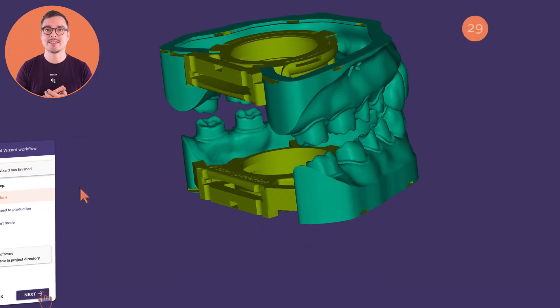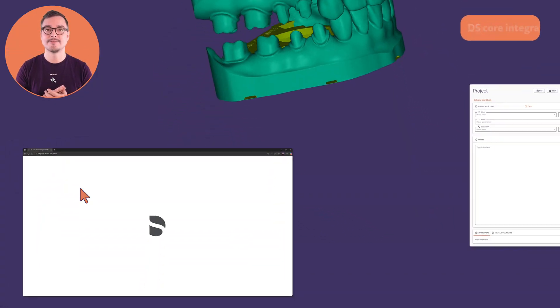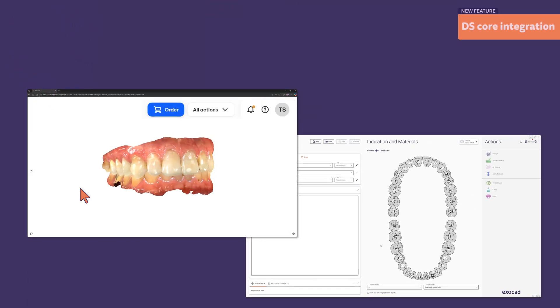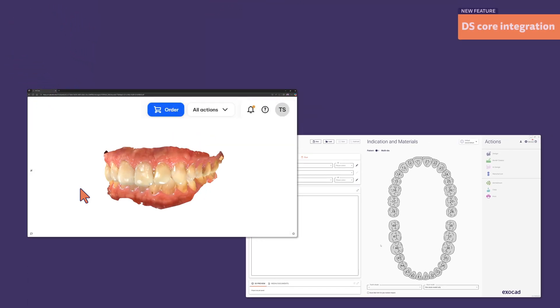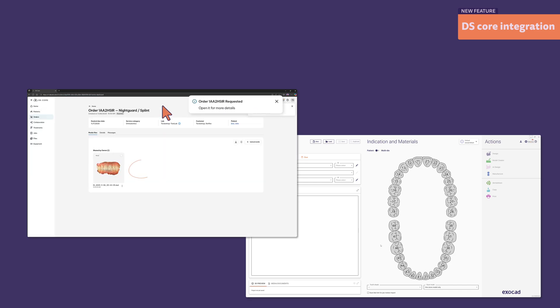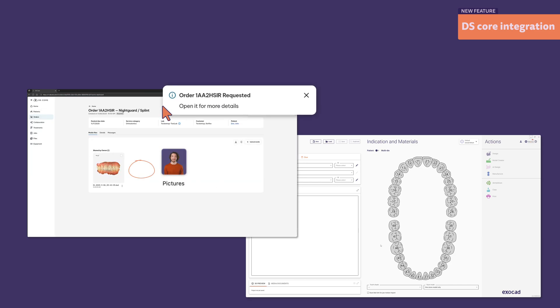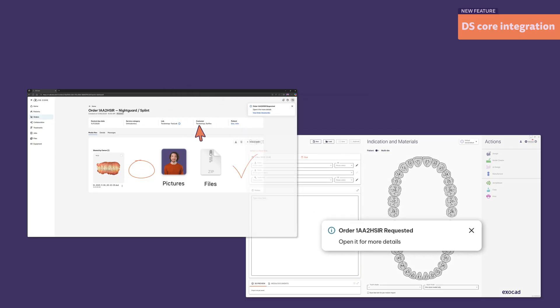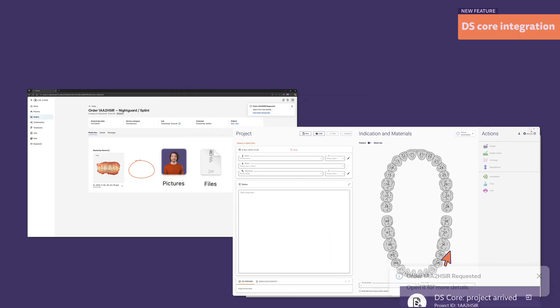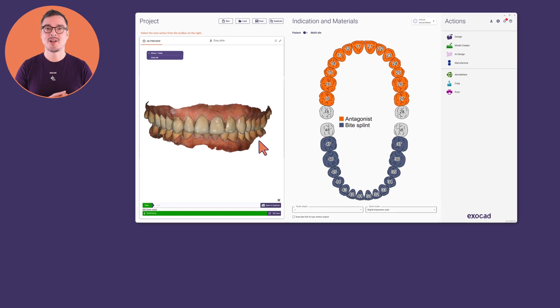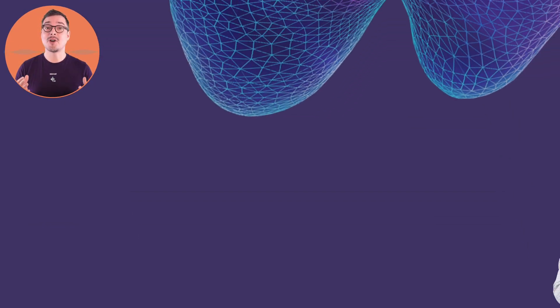The new DS Core integration with Dentsply Sirona means that once your dental DB is set up, your doctor can seamlessly send you cases including the margin line, pictures, files, and comments. Within a few minutes you will get notified and can start working on it right away.